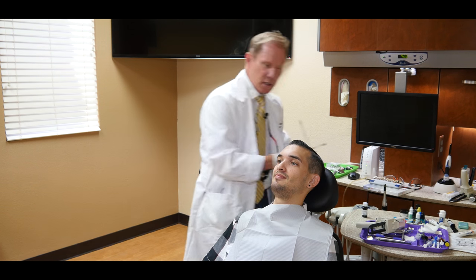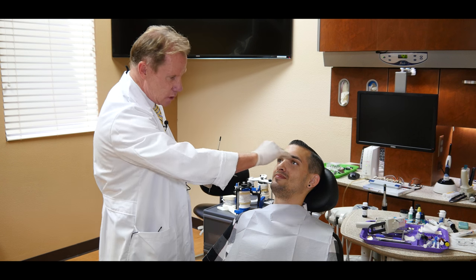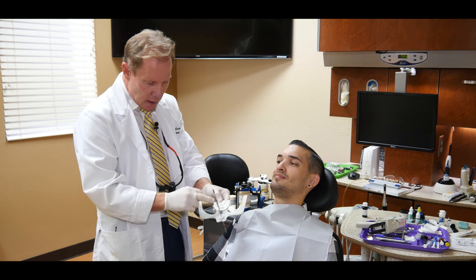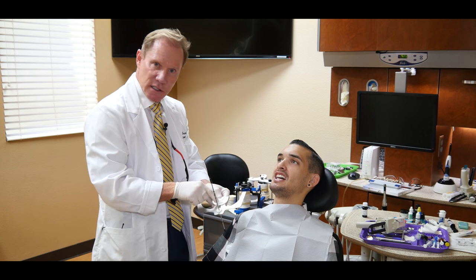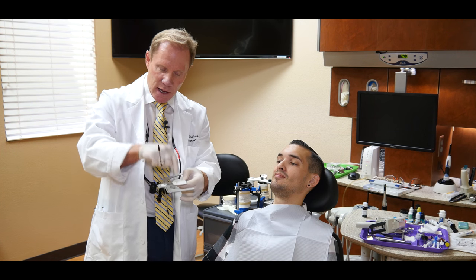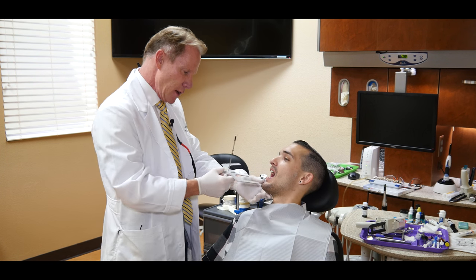Now our goal with this is to obtain the horizontal plane, which lines up with the interpupillary line, and also the vertical. And again, on this little plate we want to make sure the facial incisal of the central is right against the vertical part of the plate and the horizontal part of the plate. So go ahead and turn toward me a little bit.